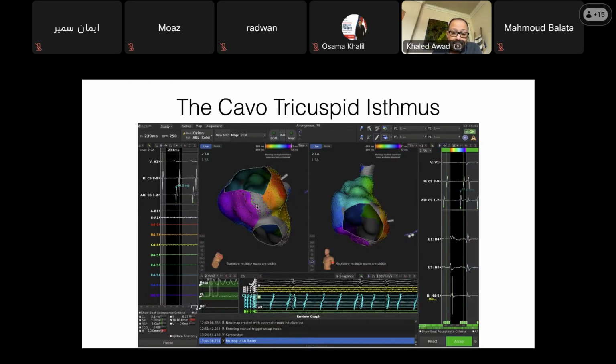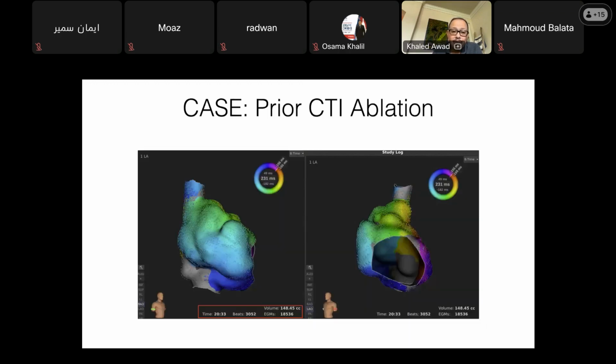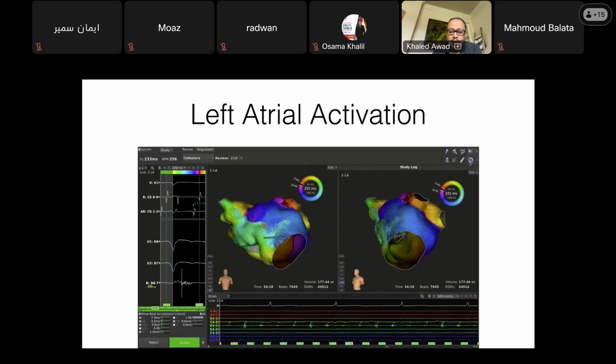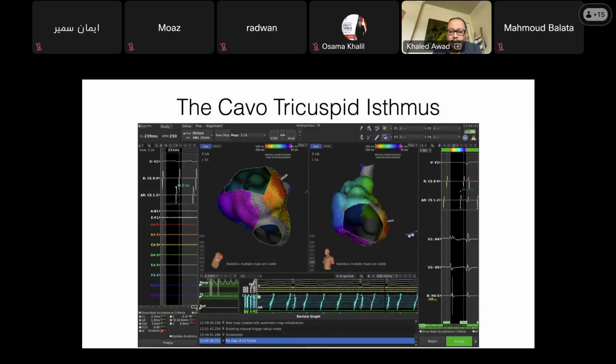But the arrhythmia was clearly eccentric in the coronary sinus. So it cannot be a typical flutter, really. But again, you've got to look at all the information you have. So this is distal to proximal activation in the coronary sinus. And so we went on to map the left atrium. Now, we were excited about having arrhythmia, and so we wanted to map this anyway.